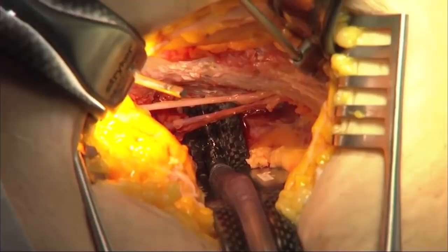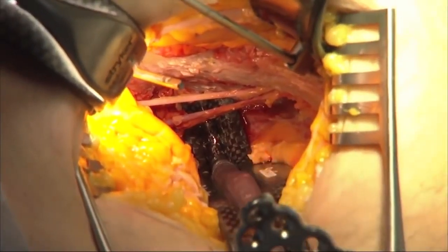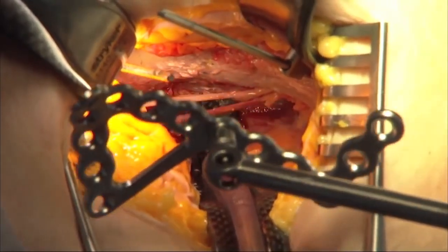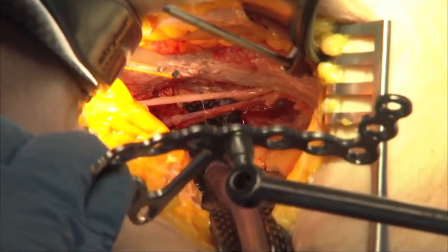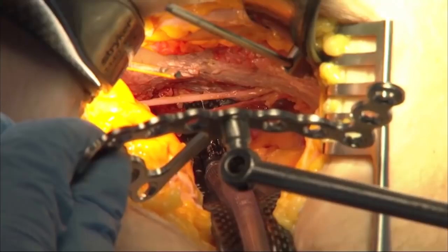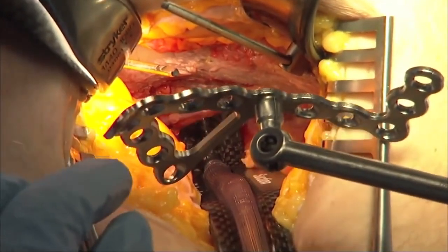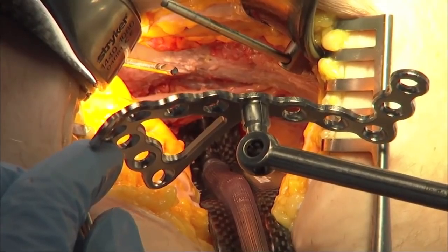Can we go back to Dr. Sagi, please? All right, so what I've got here is the infrapectineal plate. So this plate will lie below the pelvic brim, not like the plate that Mike just showed you. You can see that it's contoured to fit on the inside of the pelvic brim with an extension that comes down along the quadrilateral surface and onto the posterior column.